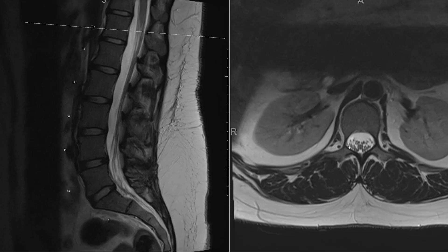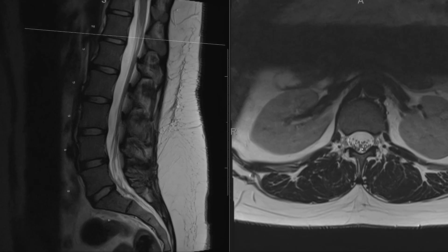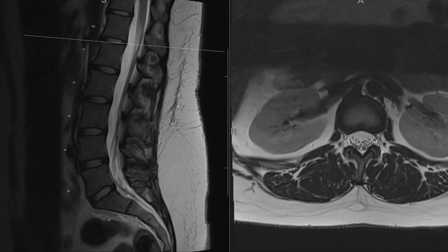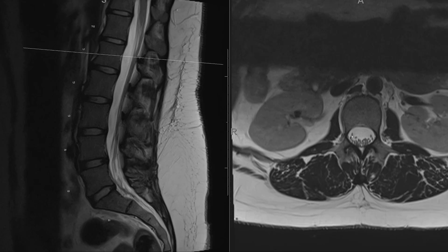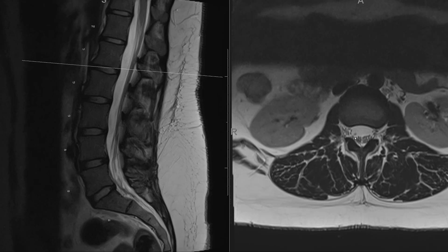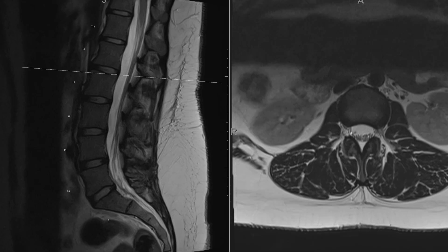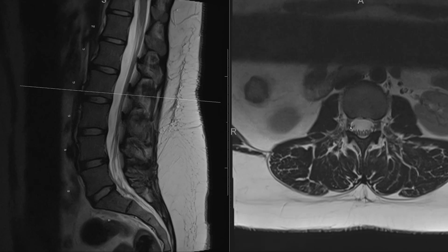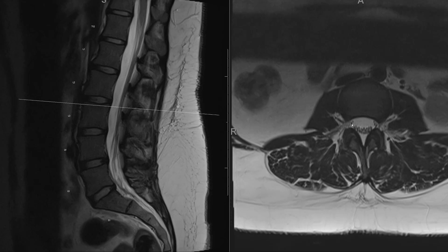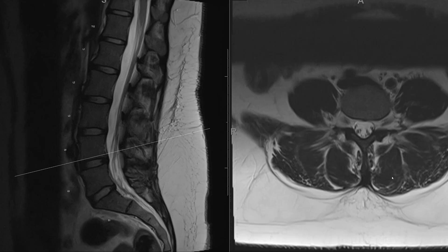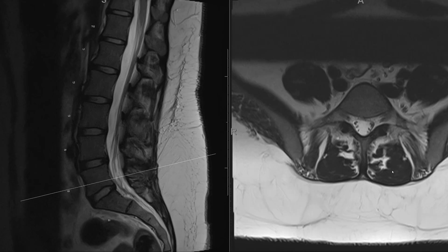On the axial images, here's the distal conus — the thicker portion — and then you have all the ventral and dorsal nerve roots. As you scroll down, they start lining up two by two, one ventral and one dorsal nerve root. They line up in the lateral aspect of the canal, and then under a pedicle they exit. The next pair line up, and so forth as you scroll down, exiting at each level.